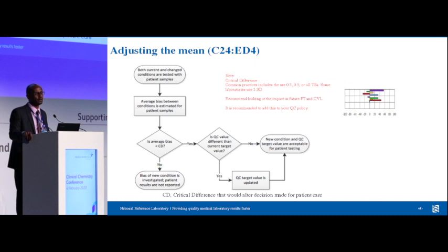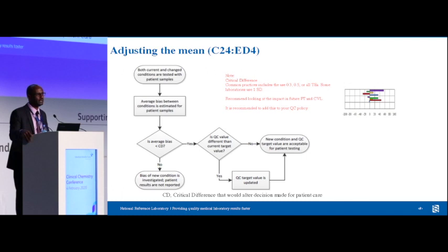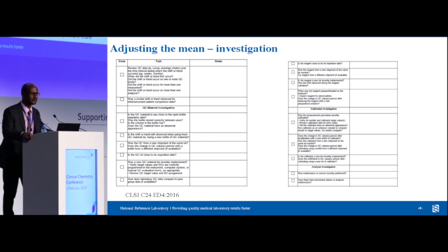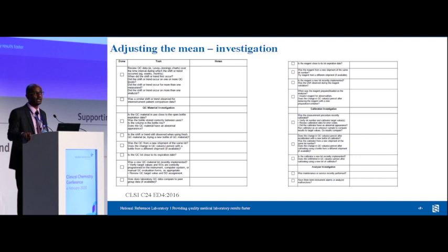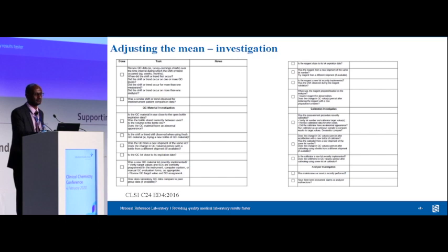Adjusting the mean is one of the most common questions we receive in the QA and technical department. People ask: we have a new reagent and the mean shifted — can we shift the QC mean as well? Or we recalibrated and the mean shifted. Historically we had no guidance on when to adjust the mean. Now CLSI provides a scientifically proven approach for when we can adjust the mean, and the CLSI document has a table with investigation techniques to help decide. I recommend adding this table to your troubleshooting section.